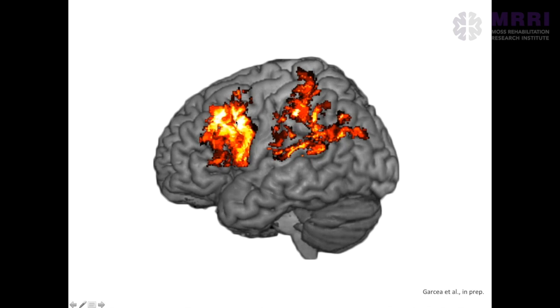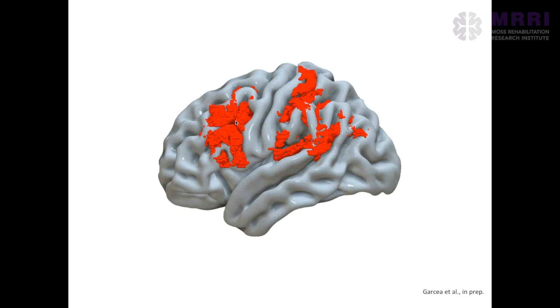I wasn't planning to talk much about this finding in and of itself, but what I want to show you is that we can start to take SVR-LSM, what I'm showing you here, and load up these same data into a surface representation like so, and we can compute the same analysis of tool use performance of our behavior with the Connectome lesion symptom mapping. And so now we can look at correspondence between where we find disconnection in the brain that predicts worse performance in tool use in this context, and where the voxel lesion symptom mapping results are in red, okay?